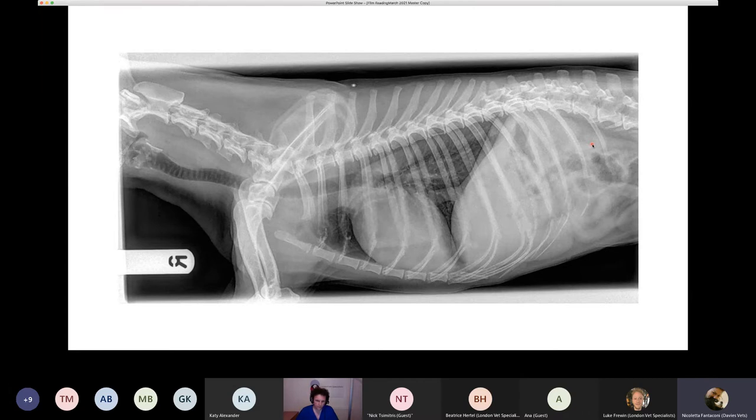And focused on the neck, there is a sort of ill-defined, rounded, ovoid-shaped structure, which is essentially ventral to the third and fourth cervical vertebra, which potentially partially effaces the trachea or slightly causes a subtle ventral concavity of it, like ventral displacement, or probably just partially effaces the dorsal aspect of the trachea. No, I think you're right, I think both. And this structure is more visible on the right lateral, so I'm expecting it is more on the left side, but it is also visible on the left lateral projection.